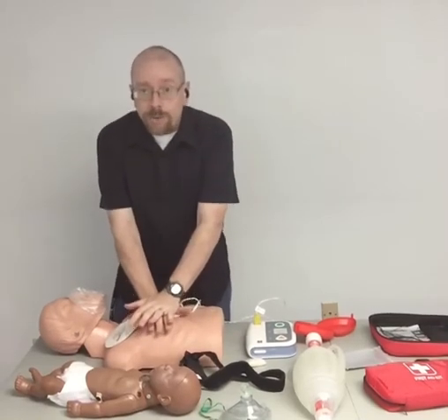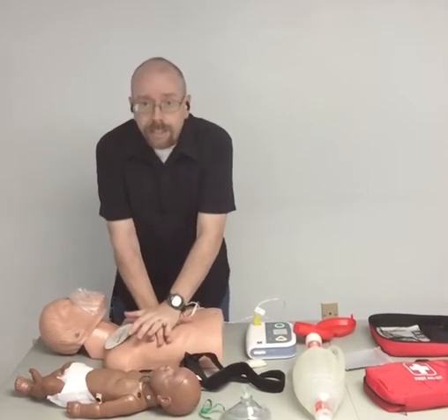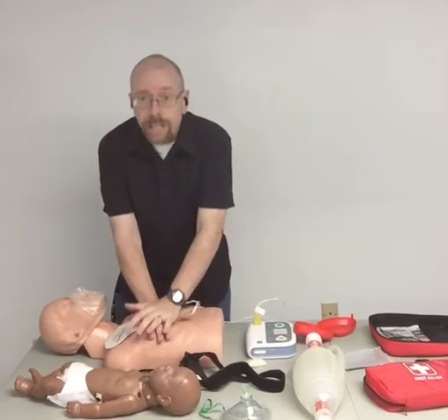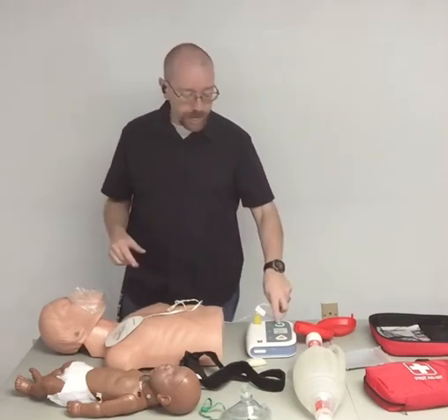So now you can just do compression-only CPR for 2 minutes without breathing if you don't have proper airway devices. Otherwise, you're doing 30 compressions to 2 ventilations, and you'll keep doing the 30 compressions, 2 ventilations till the defib tells us to stop when it starts to reanalyze.